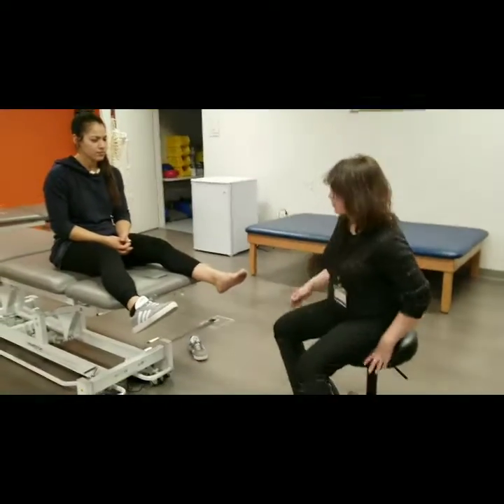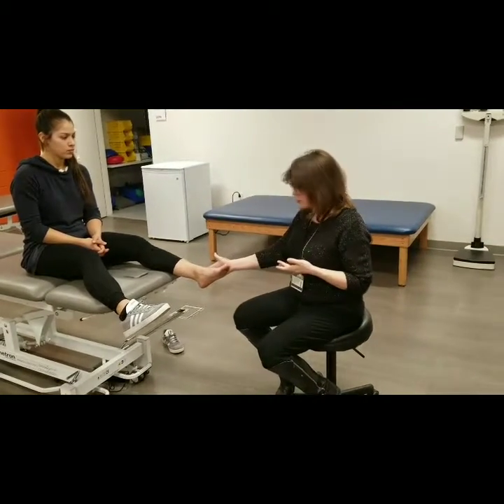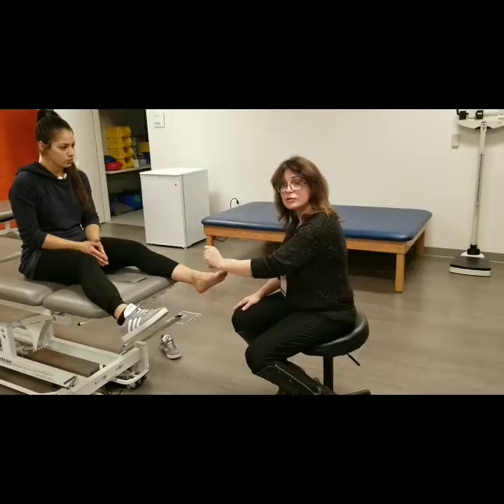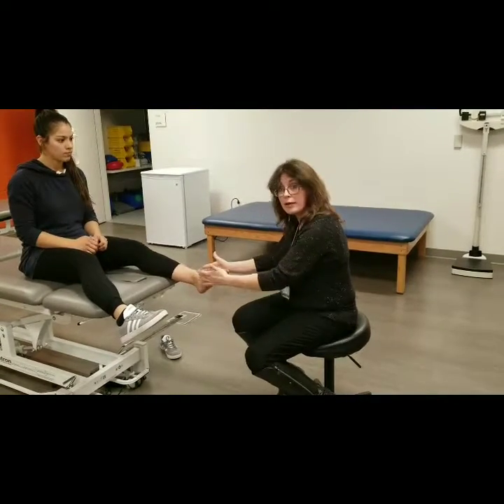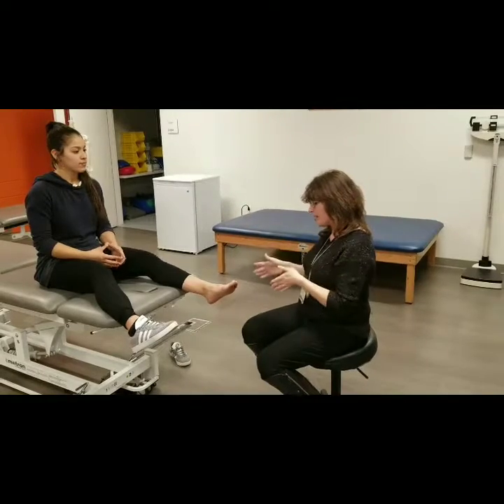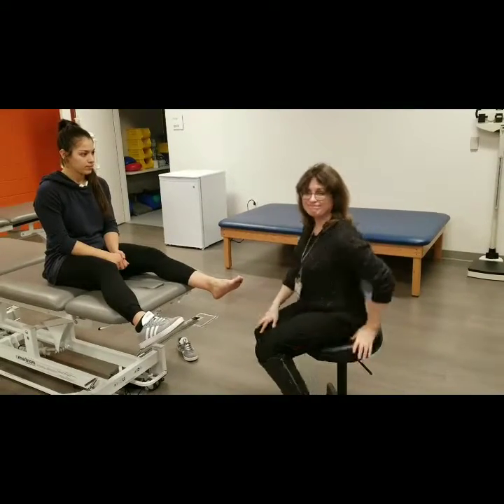Of course, before we apply the bandage, we would apply some extra padding. If there were any arterial ulcers, we would pad the lateral malleolus, but since this is a venous insufficiency, it's the medial malleolus that we would be concerned with. So that's where your extra padding would go, on the malleoli, specifically the medial. We're going to be using a short stretch compression bandage because this patient is ambulatory. This short stretch bandage increases compression upon ambulation.